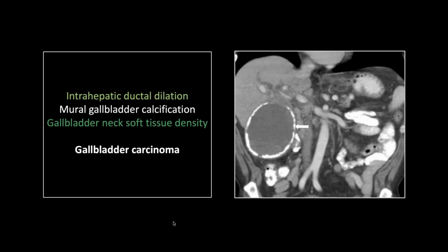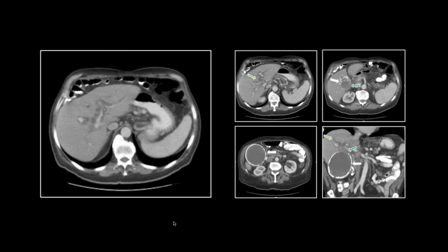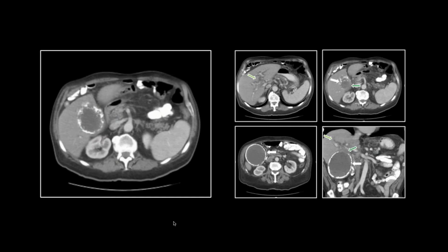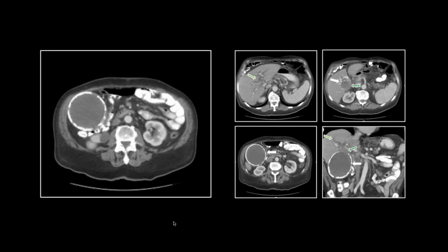Huge distended calcified gallbladder. And look, there's that rarefied calcium with a soft tissue mass extending up into the portal region. And it's actually that's causing the biliary dilation. So there's that biliary dilation. Then we can follow that down. There's the soft tissue mass, right? And there is the remainder of the calcified gallbladder.